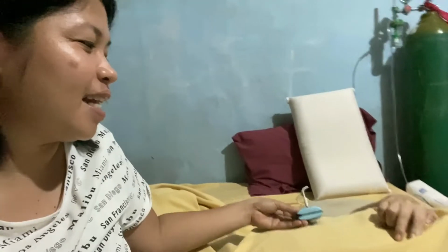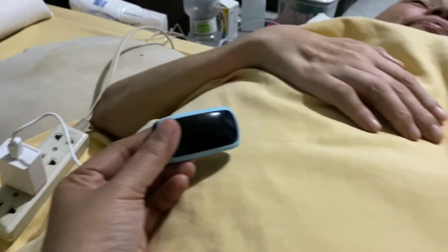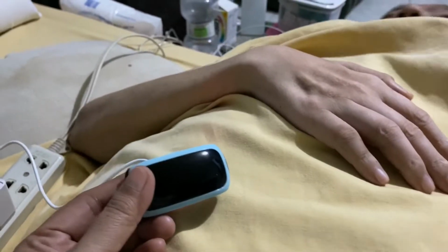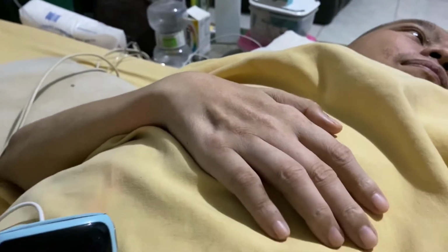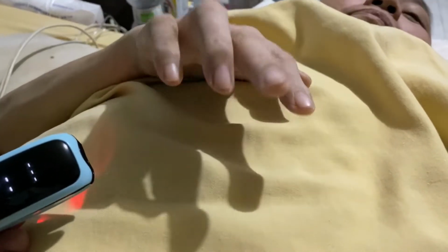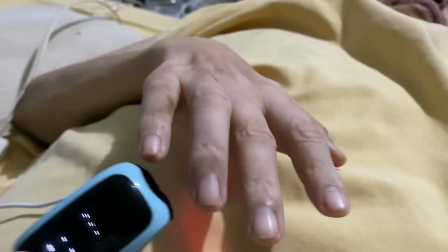Okay, so we will try the oximeter. We will show you how the oximeter works. It has an indicator of the pulse rate and the oxygen level. Okay, Kurt, you will need the middle finger.